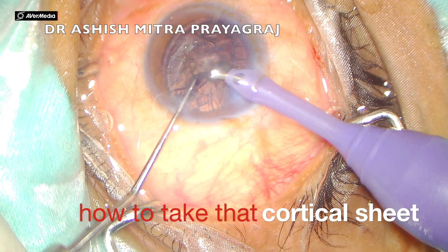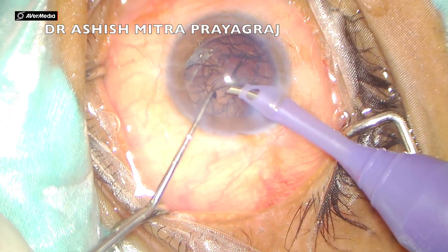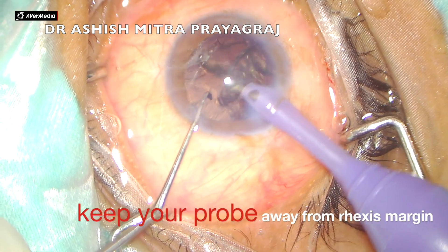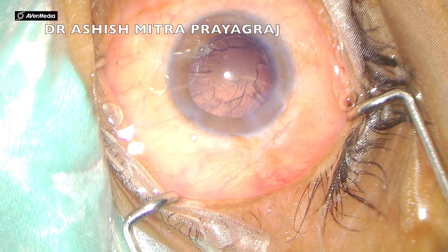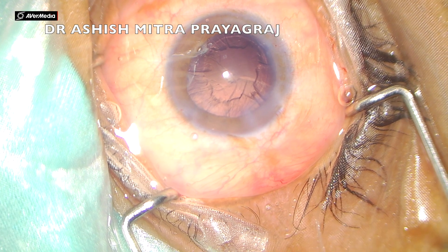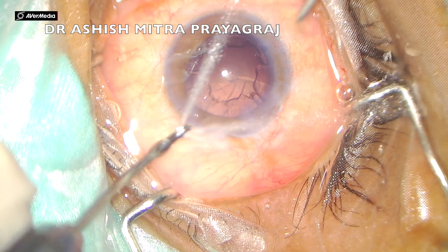Now this video also shows how to take that cortical sheet. You have to go to foot position 2 to manage it — just give a bit of aspiration and sweep your phaco probe sideways. See here I am sweeping, and see how well you can aspirate the cortical sheet. The whole job was done, and what is left is the remnant cortical fibers, which are taken with irrigation and aspiration.